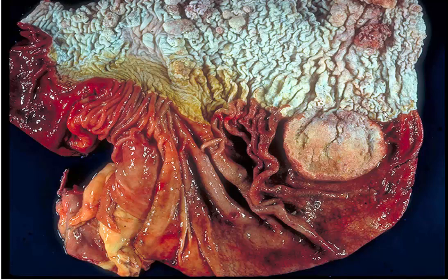The other thing that will pop up right here along the margo plicatus, or the part that separates the squamous and the glandular portion of the stomach where they come together, are granulomas caused by Draschia megastoma. That is a parasite that is transmitted by flies, and it gets into the animal's oral cavity.